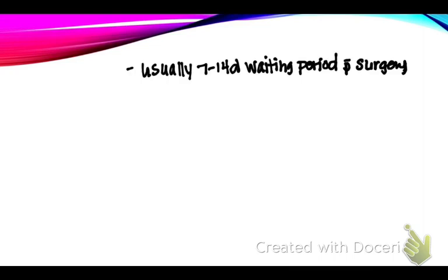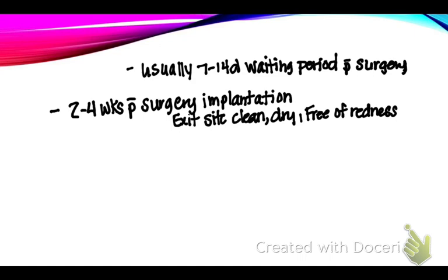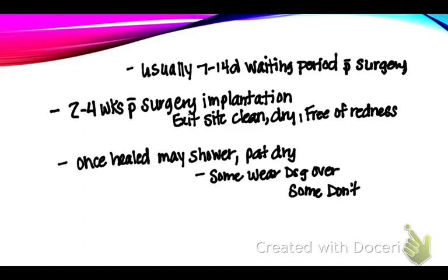Now, as far as using that Tenckhoff catheter, usually there's a 7 to 14 day window after surgery, and then 2 to 4 weeks after surgery or implantation, if the site's clean and free of redness, they can use it. Once healed, they can shower, they can pat it dry. Some wear dressing over it, some don't. But they can't just sit in a body of water, but showers are okay.